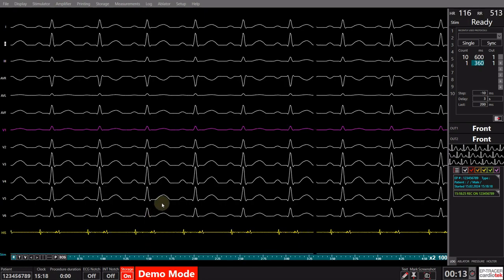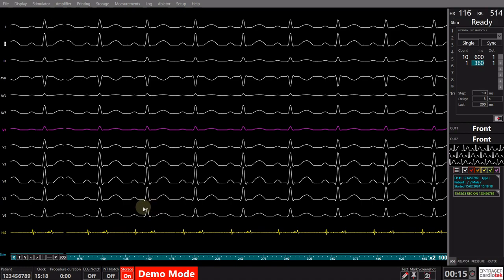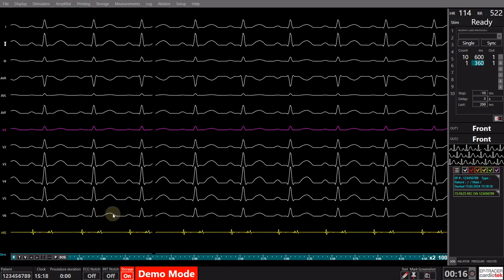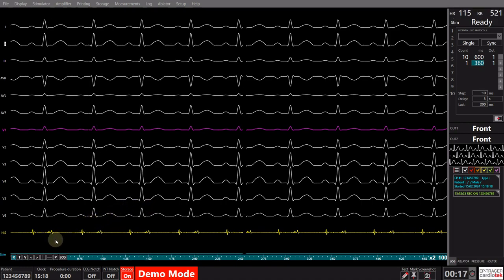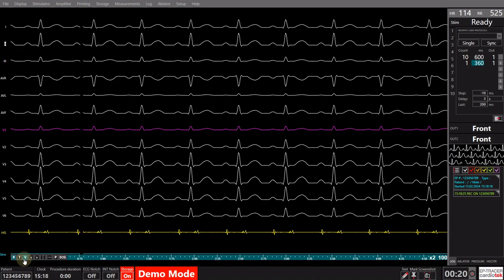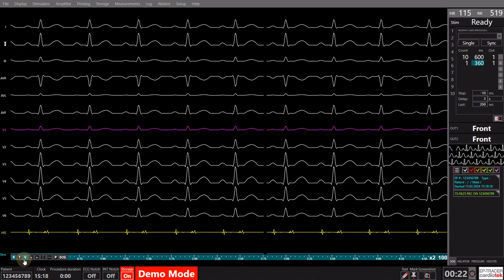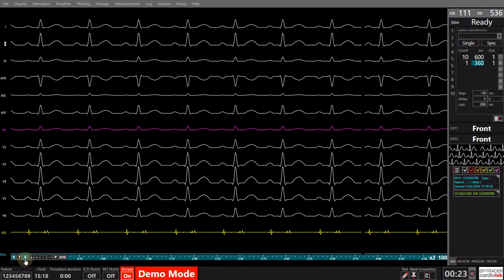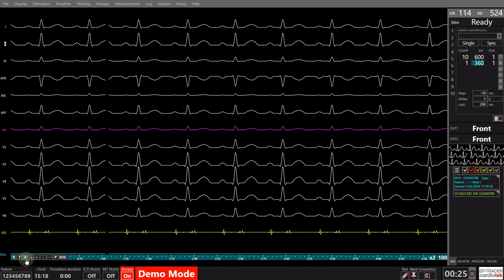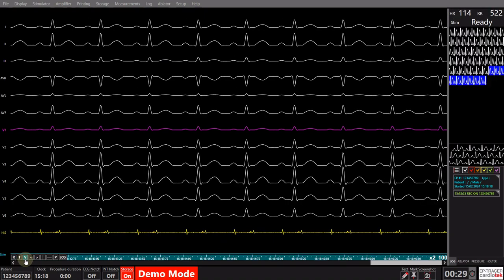During the procedure, the physician may request specific measurements, and to ensure accuracy, these should be taken in view mode after freezing the signals. To transition from real-time to view mode, click the V button, or press F1.